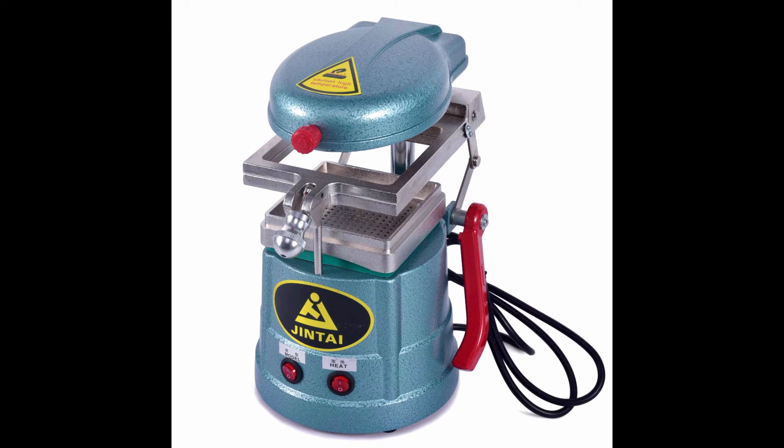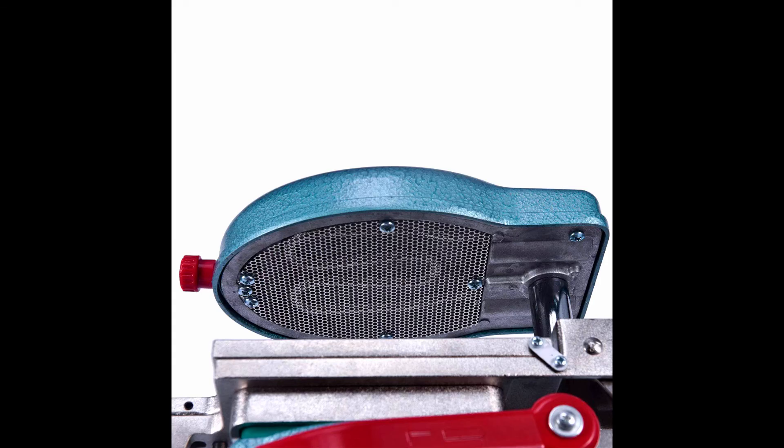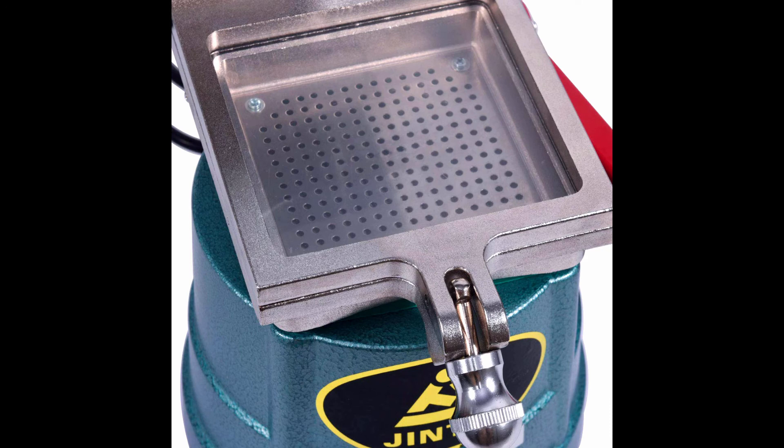Compatible with all dental thermoplastics and suitable for a wide range of clinical applications. Suitable for various types of thermoplastic sheets — universal size 5x5 thermoplastic sheets can be applied in this vacuum forming machine. Ideal for making dental guards, orthodontic retainers, night guards, and mouth guards. We strive to provide high quality and valuable dental products to dentists and students to make their work more convenient and efficient.